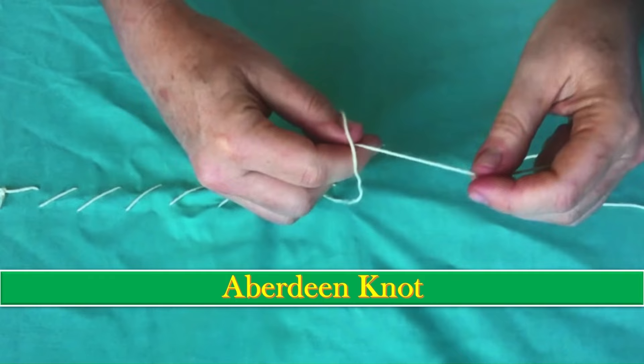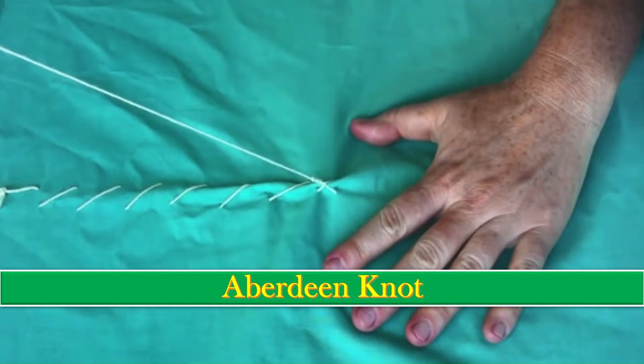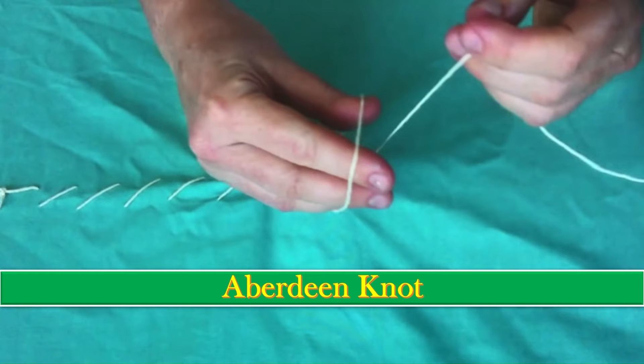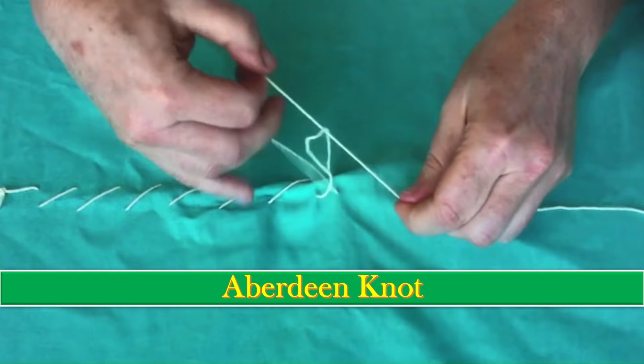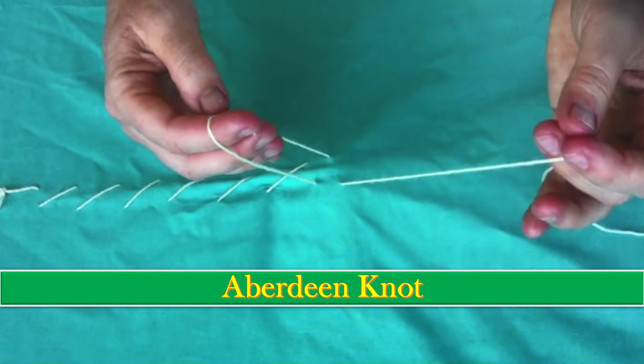The last type is the Aberdeen knot. To finish the continuous suture pattern, pull the final loop of the suture loose, then pull the free end of the suture through the final loop whilst creating a loop with the free end. Pull the new loop through — this equals one throw. Place more throws in the same way as per recommendations. To end, pull the free end through the loop completely without creating a new loop.